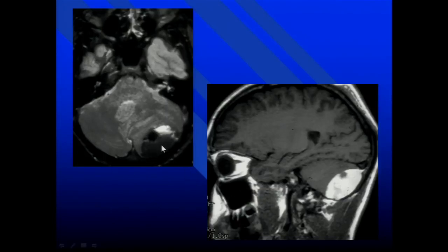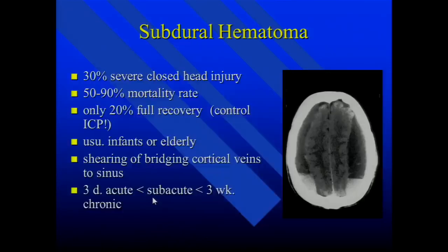Of course, the blood imaging characteristics here, I can be more precise, not just saying, well, it's probably a week old or 2 weeks old or 3 weeks old, being acute, subacute, chronic, which we do on CT. You know, here I have deoxyhemoglobin, ISO on T1, dark on T2, as well as intracellular methemoglobin, bright on T1 and dark on T2. So I have a pretty good idea that this occurred about 3-4 days ago, with the mixture of those two blood characteristics. I'm not going to go over all the differences of blood on MR, but you should, of course, be aware of that. Okay, subdural hematoma.